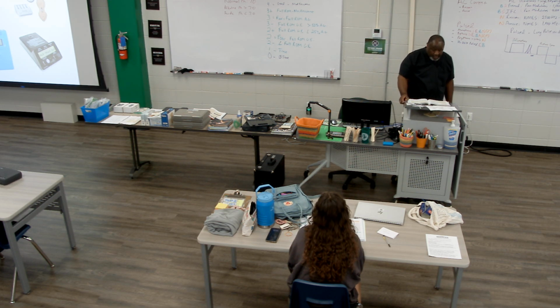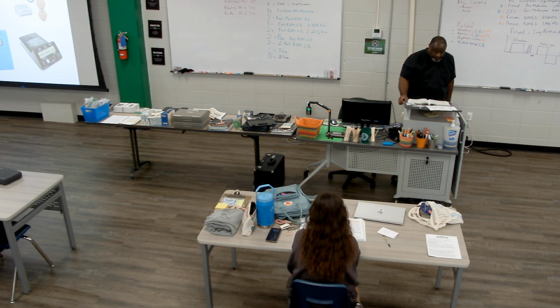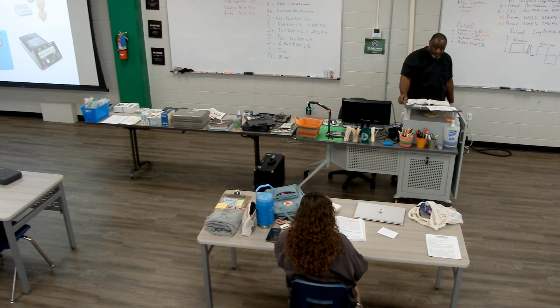The FDA is responsible for testing and regulating all devices that are used on humans in the United States. Iontophoresis kits have been classified by the FDA as Class 3 devices. They have not undergone clinical trials because they were marketed before 1976.